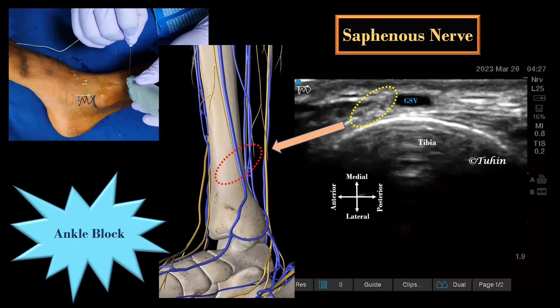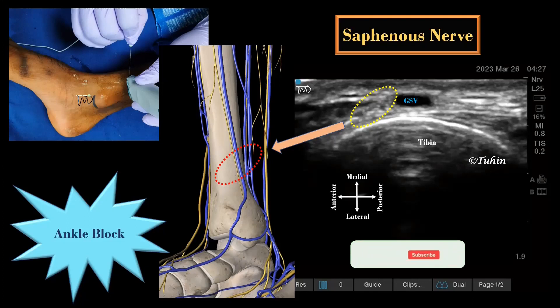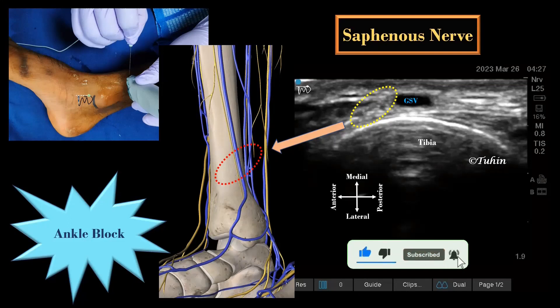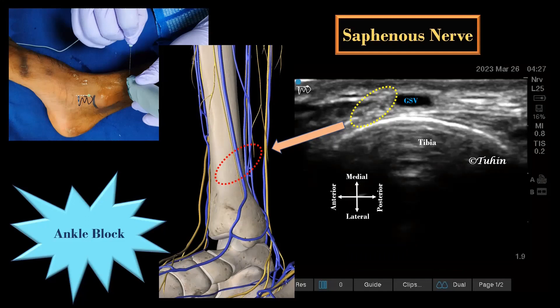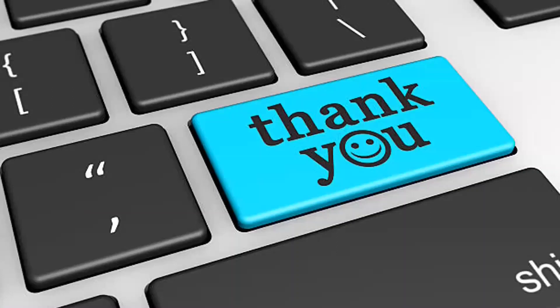In the last two nerve blocks — sural and saphenous — our anatomical landmark is the vein, so be gentle with the probe while scanning to avoid obliteration of the veins. Alternatively, a tourniquet or blood pressure cuff can be applied in the upper third of the leg and inflated to provoke distension of the lesser saphenous or greater saphenous veins, helping with anatomical localization of the nerve.